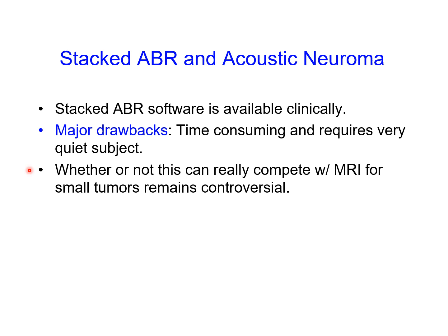As an audiologist, we don't have the power of prescribing MRI yet, but we do have the power to record ABRs and stacked ABRs to help us identify patients who potentially may have tumors. We can then refer them to neurology for further evaluation.